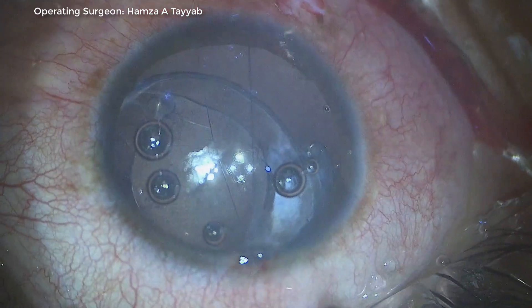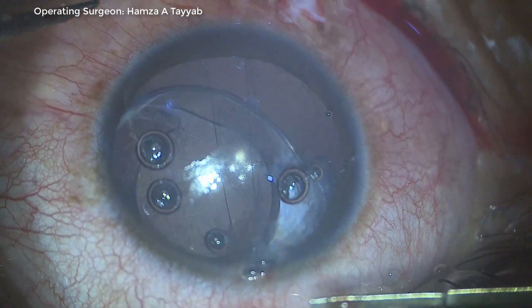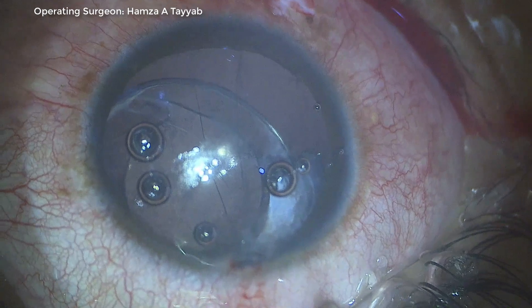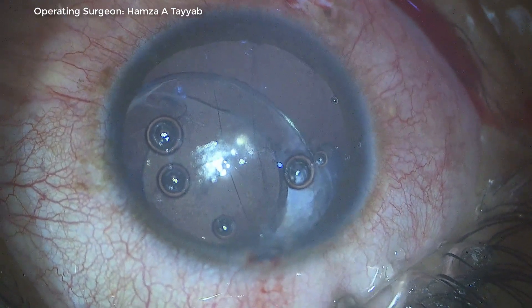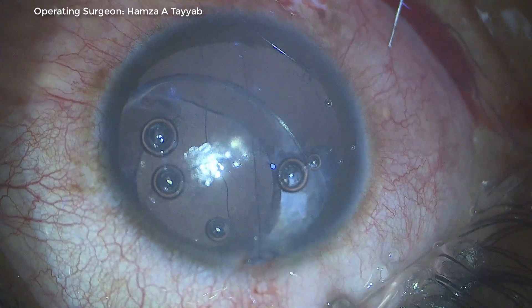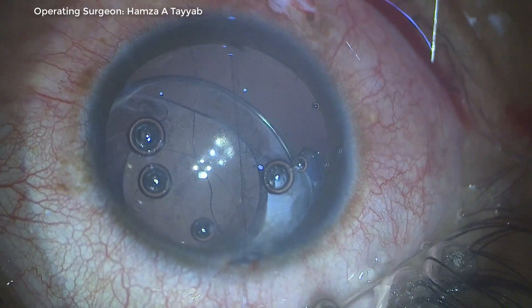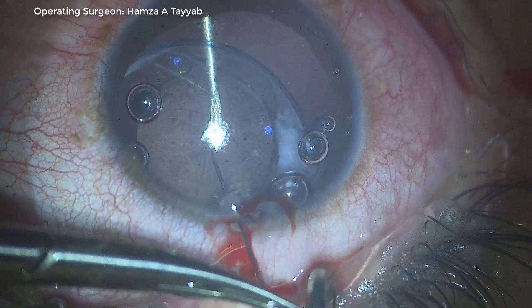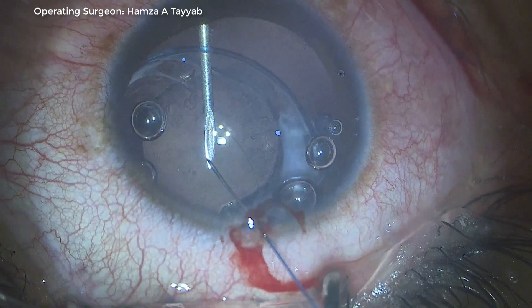The loop is stuck in the corneal stroma and after many maneuvers it is very difficult to pull it out. In retrospect, I could have pulled the loop out of the eye and pulled another loop of the second suture, cut it, and tied both ends after releasing it from the stroma — but that idea did not come to mind at the time. I have now cut the threads and decide to pass a fresh double-arm suture, this time being careful to avoid penetrating the corneal stroma.